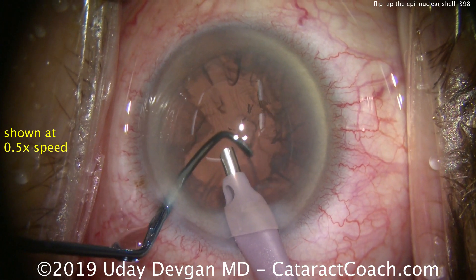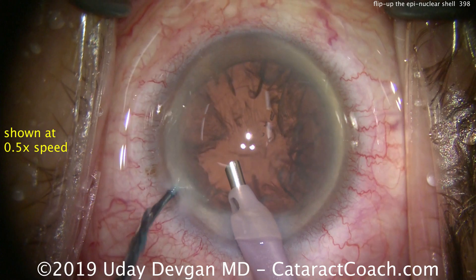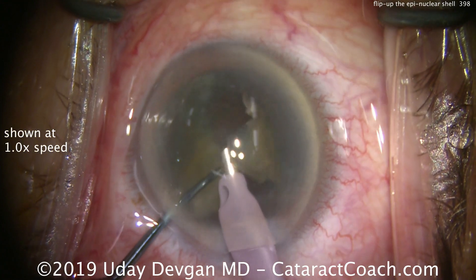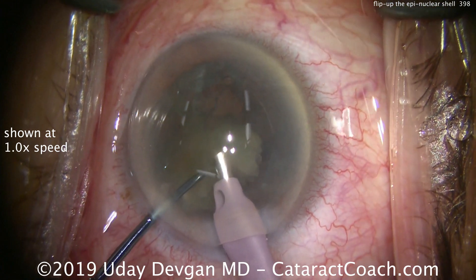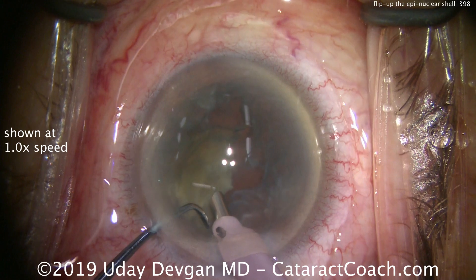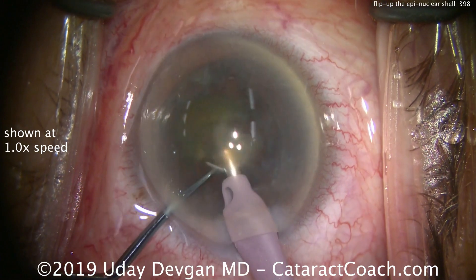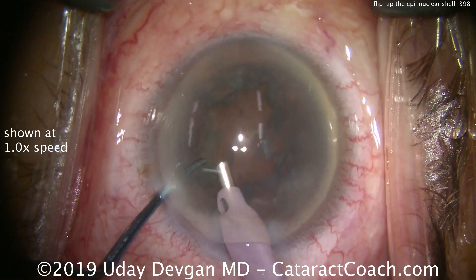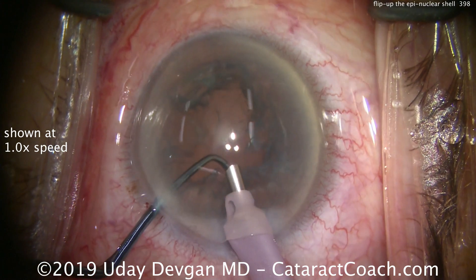Very safe technique, very efficient — much better than doing I&A. Watching it again in real time: taking out the piece of nucleus, here comes the last few bits, there's the last quadrant of nucleus. Take that out as well, nice and easy. Chopper is in the protective position; now we're ready.